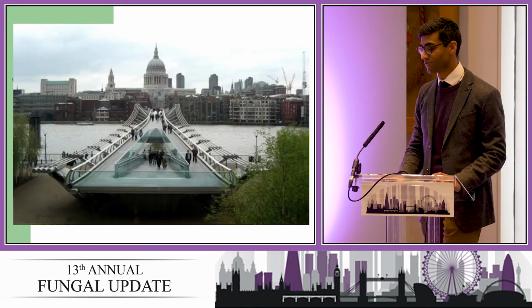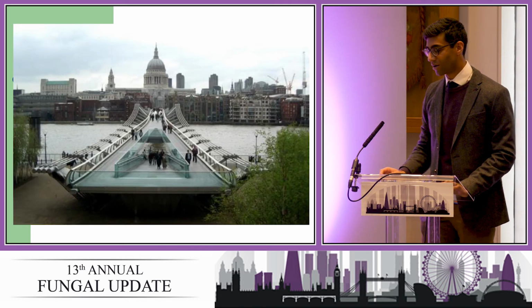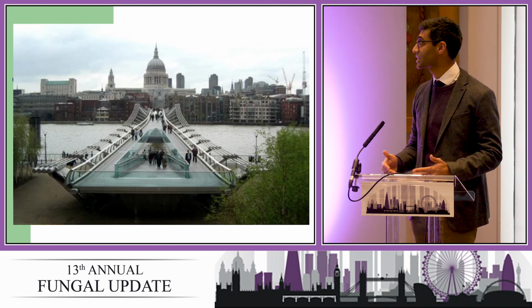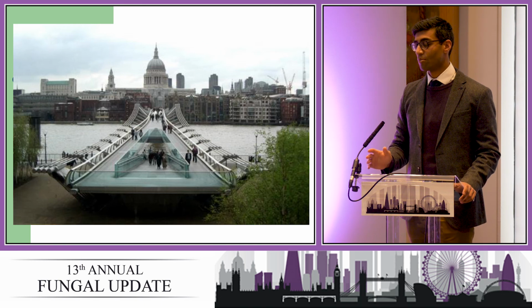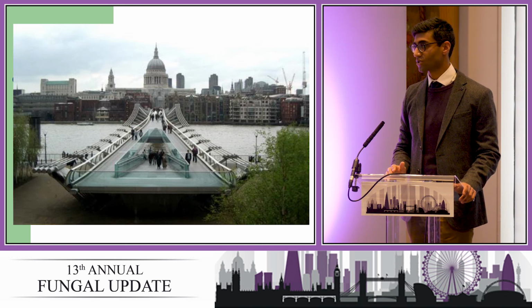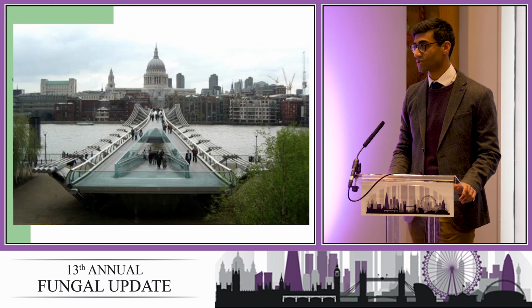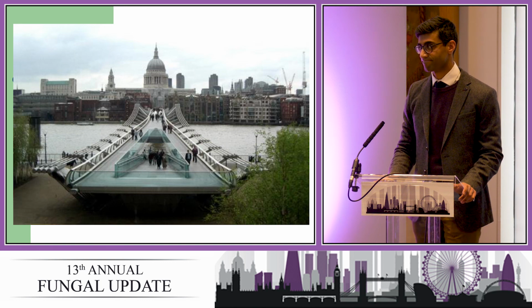Any questions? So that was just a quick run through the imaging of graft versus host disease. The main message that I wanted to get across is that it's not just above the diaphragm. You can see it below the diaphragm, primarily pre-day 100 post-transplant. Post-day 100 is when you should be considering pulmonary graft versus host disease.